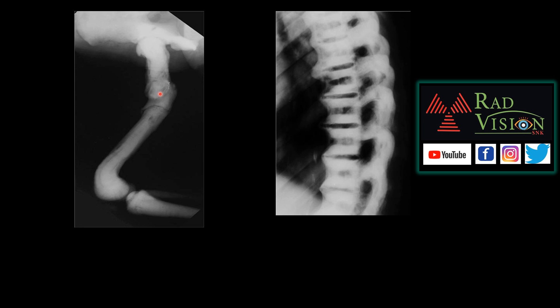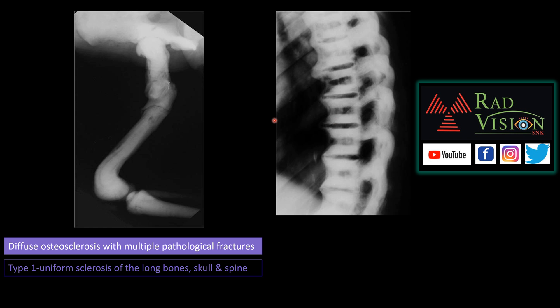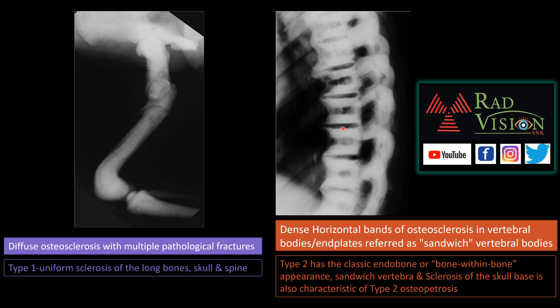This is a classical case of osteopetrosis. In another case, you can see diffuse osteosclerosis with pathological fractures and diffuse osteosclerotic bands at the vertebral end plates, which are typically known as sandwich vertebra.